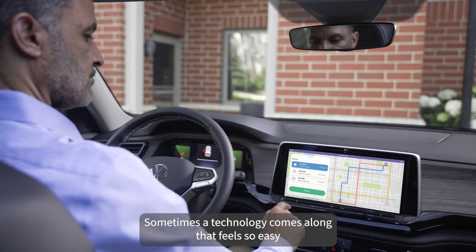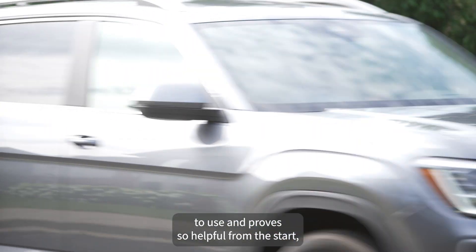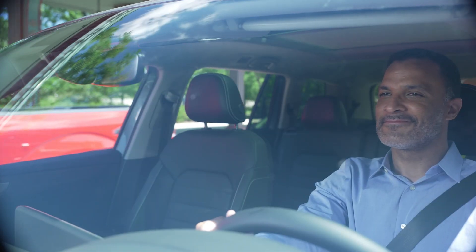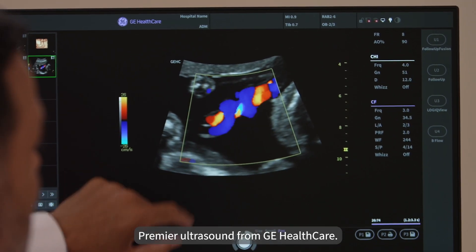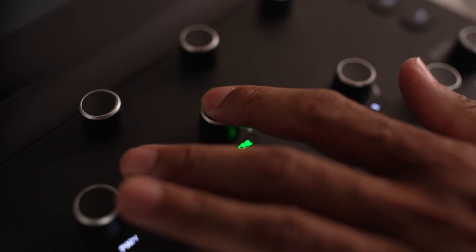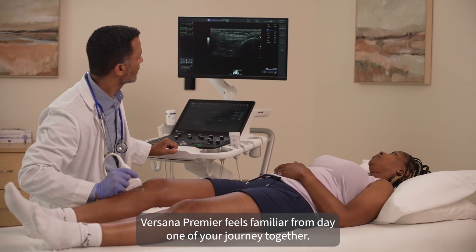Sometimes a technology comes along that feels so easy to use and proves so helpful from the start, you look back and wonder how you ever lived without it. Welcome to the world of Versana Premier Ultrasound from GE Healthcare. With advanced features that are as intuitive as they are innovative, Versana Premier feels familiar from day one of your journey together.